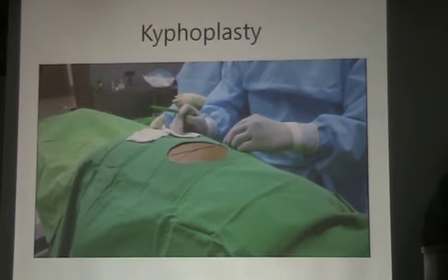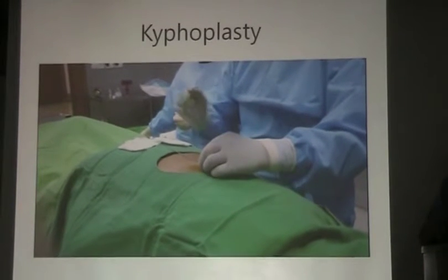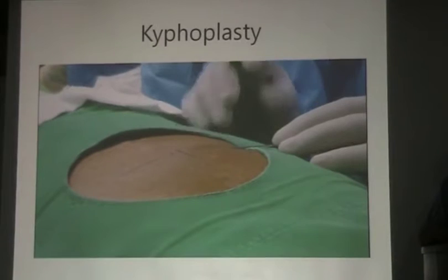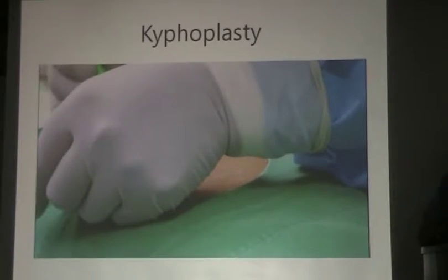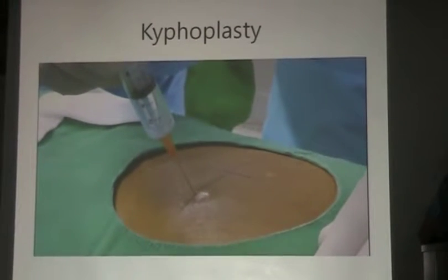Preparation of the operation field and making the entry point are the same as vertebroplasty. Check the middle line and make the entry point. Local anesthesia, just needed.